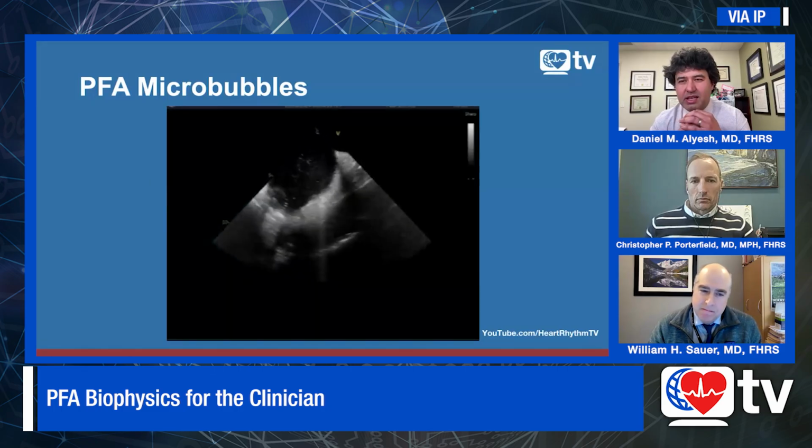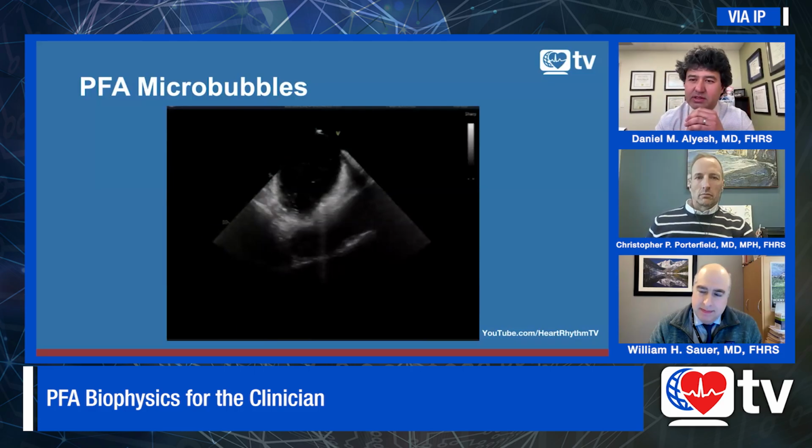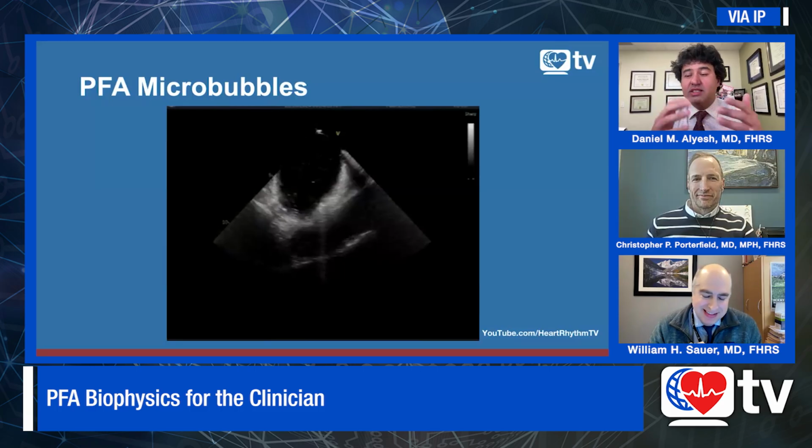I agree, and my understanding, at least from the reading, is that with PFA microbubbles, the energy can cause a little bit of nitrogen to be released into the blood pool and then reabsorbed. They claim in transit. And the more aggressive your waveform, the larger these PFA microbubbles can be, and actually the more clinically significant they can be. But it's jarring to see this.